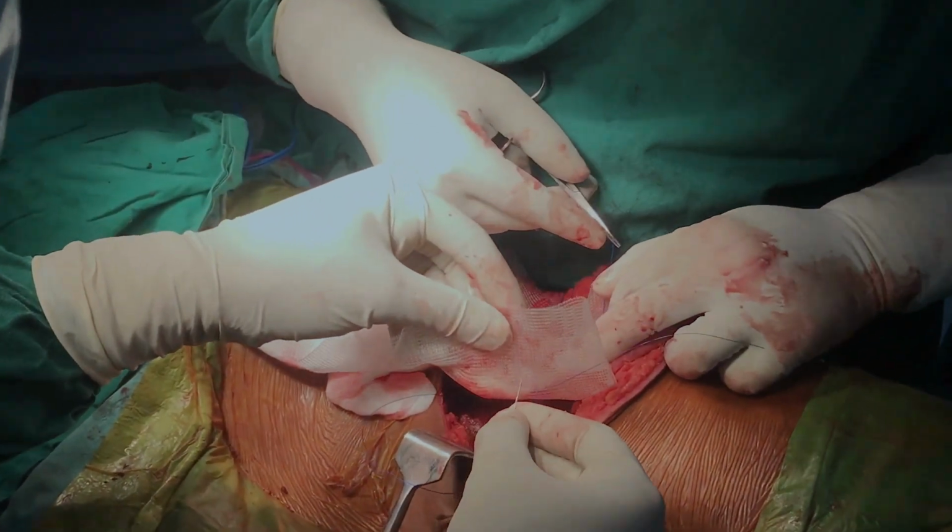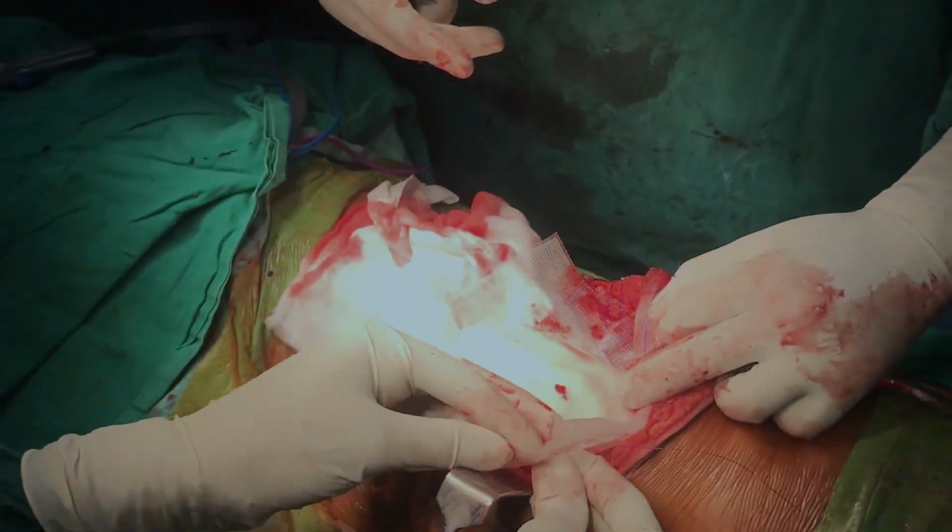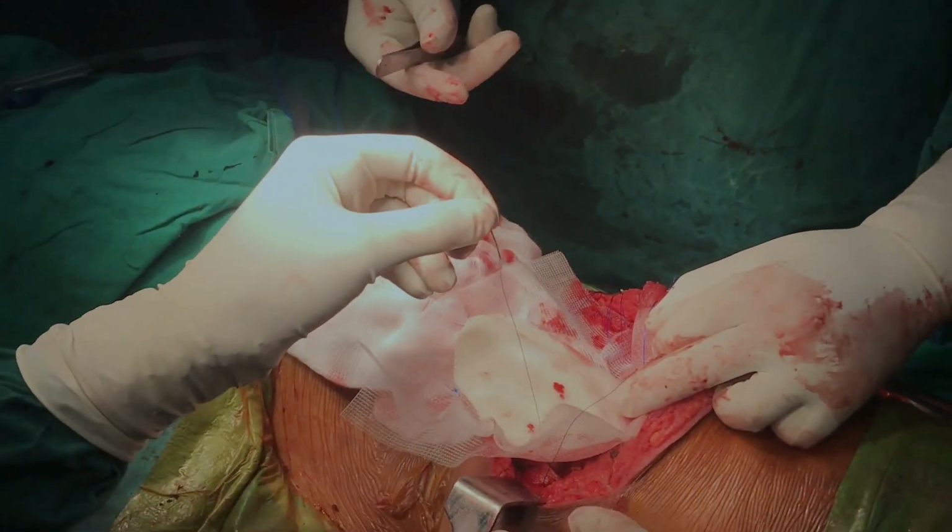So here is the bone cement sandwiched within the Prolene mesh that is being used to reconstruct the chest wall defect.